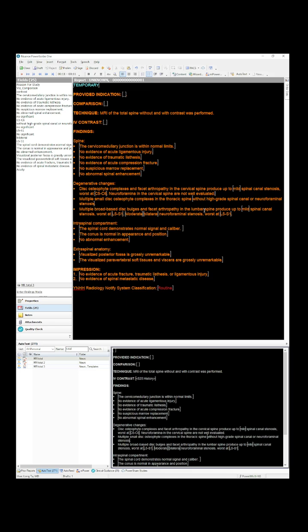Sometimes less is more. You can confuse the picture if you add a whole bunch of stuff, and you can get lost in the weeds. So at least that's my perspective, and that's how I work. And similarly, frequently this statement is true for when we do these, and if not, then I'll modify.